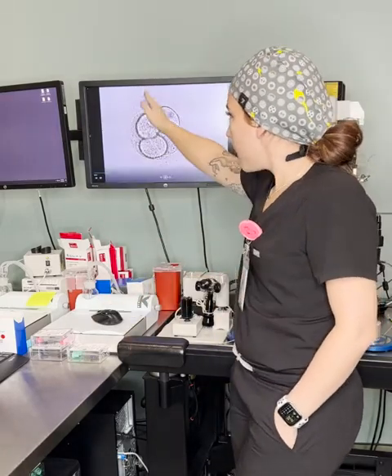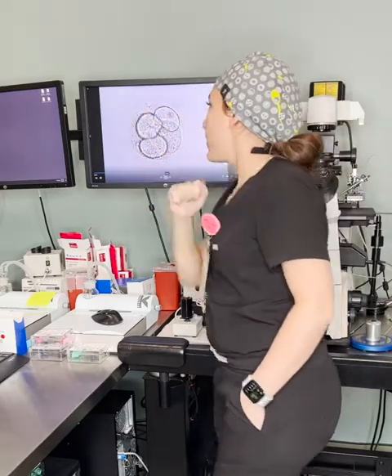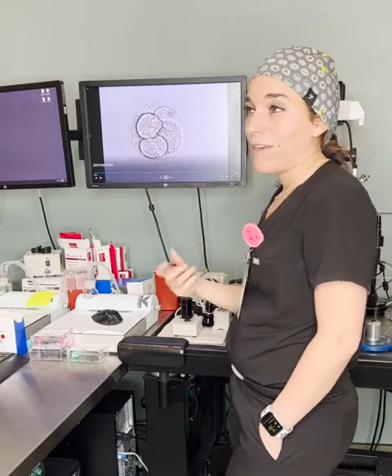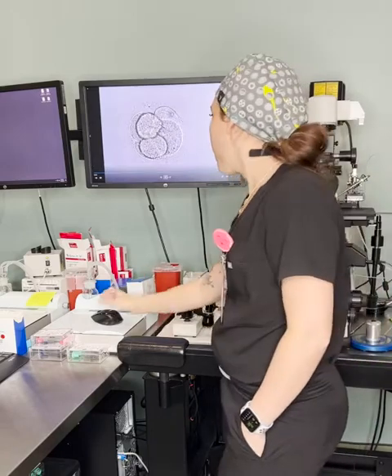So as you can see, it's making a clear cut in the zona, the shell of the embryo. Right here, you could see that hole is pretty clear. So again, day 3, day 4, day 5, day 6, PGT. This needs to be done in order for us to biopsy that embryo for you.